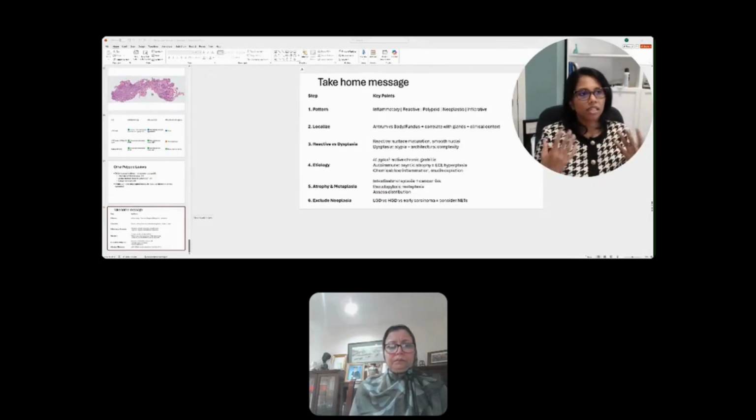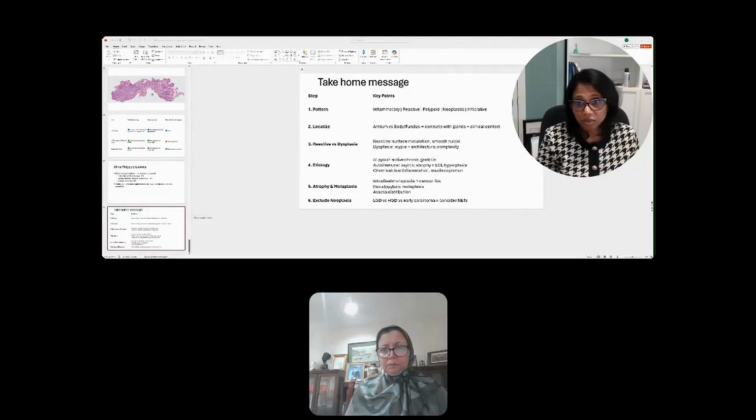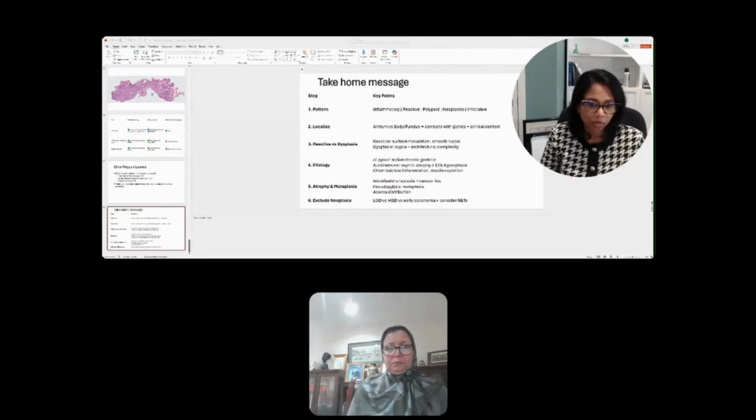But in terms of entities that I will report absolutely without, it's usually the mesenchymal lesions. I do look for adenocarcinomas that I see. I'd like to look at the endoscopic report to see the extent of the tumor, but you don't necessarily need it, but I would look to be sure. And certainly some biopsies are done elsewhere, because we're a quaternary referral center.